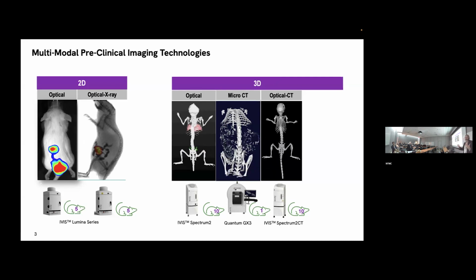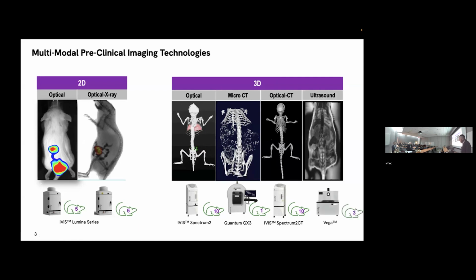With the optical, which will give you just a topographical distribution of the lesion, you can now graft a micro-CT, or what we call an optical CT. Unfortunately, the computer is just acting out.